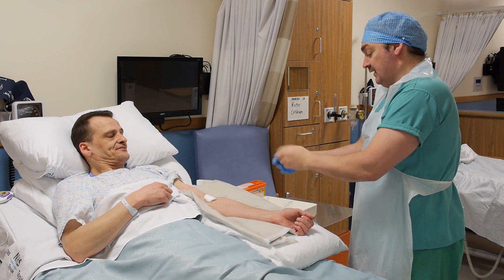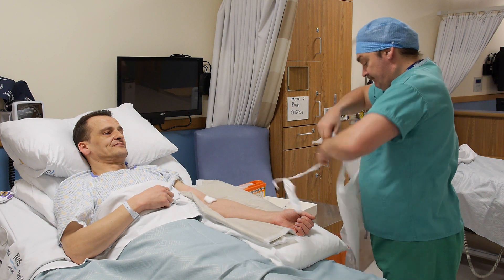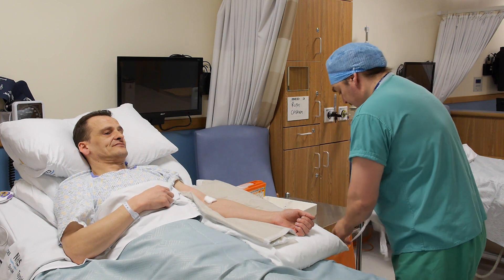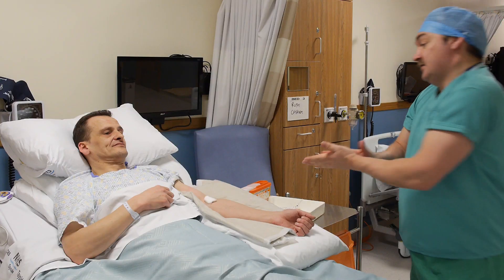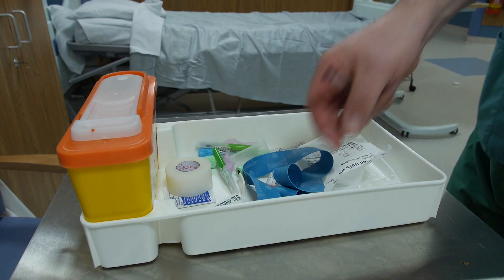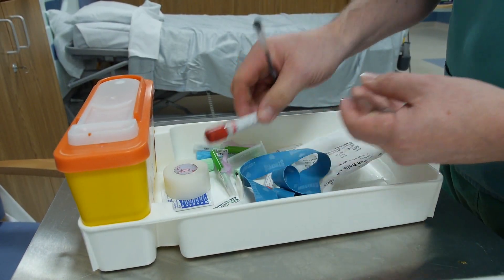Dispose of gloves, then apron, in that order, into your waste bag. Decontaminate hands and label the bottles at the patient's bedside with the patient's details, checking that they correspond with the patient's notes.